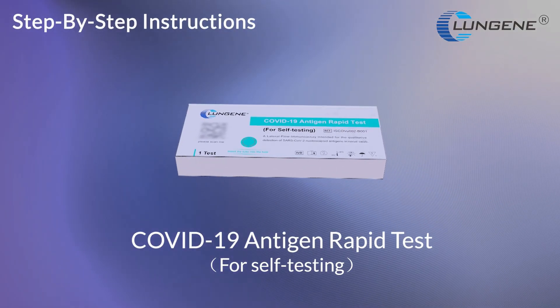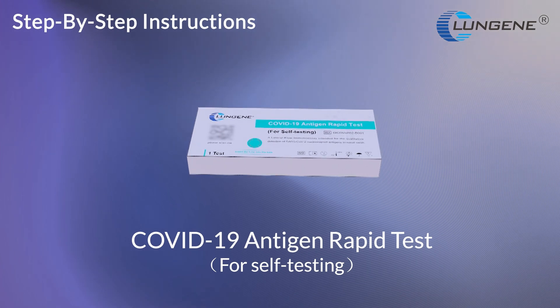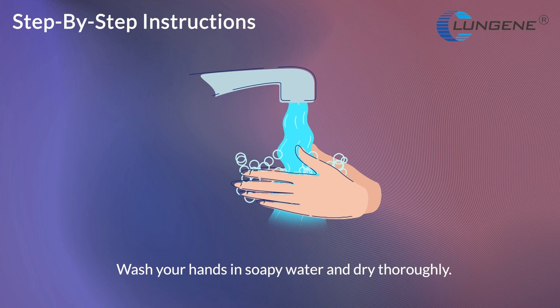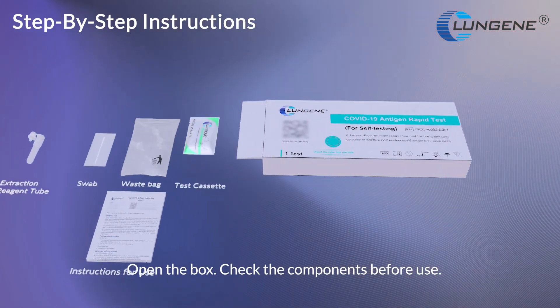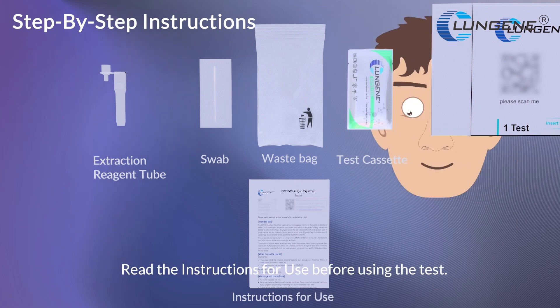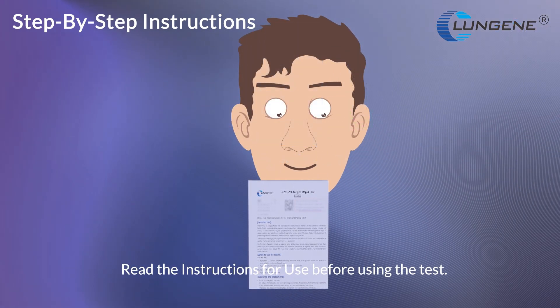COVID-19 Antigen Rapid Test Self-Testing. Wash your hands in soapy water and dry thoroughly. Open the box and check the components before use. Read the instructions for use before using the test.